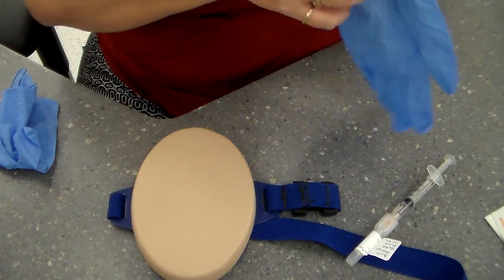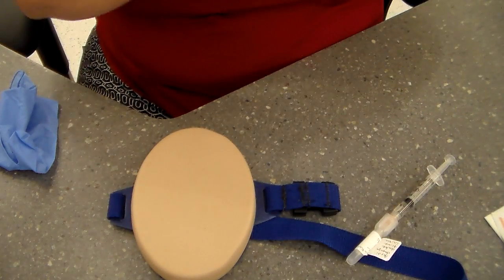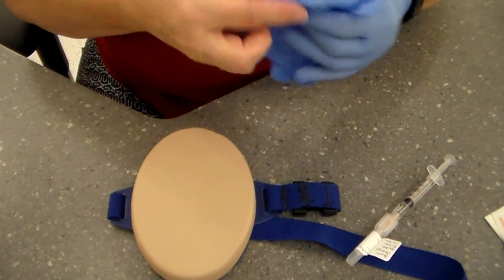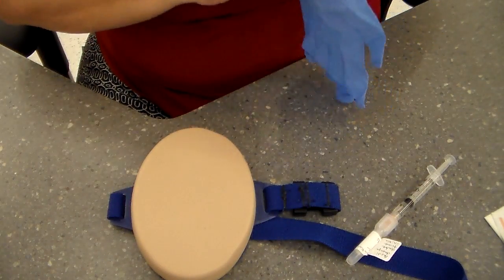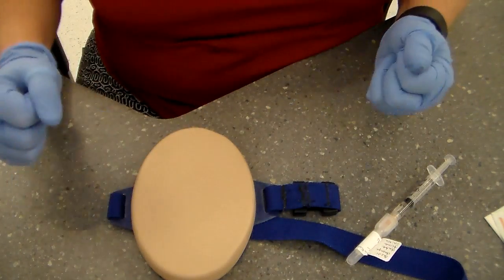Now, with all the other ones, I didn't have gloves on when I was preparing the medicine, did I? No. We're putting gloves on now because we may come in contact with blood, right? So we want to make sure that we have clean gloves on. Okay, so I've got clean gloves.